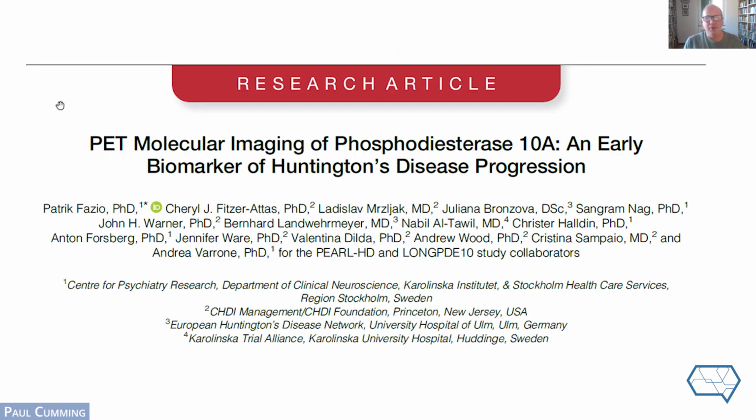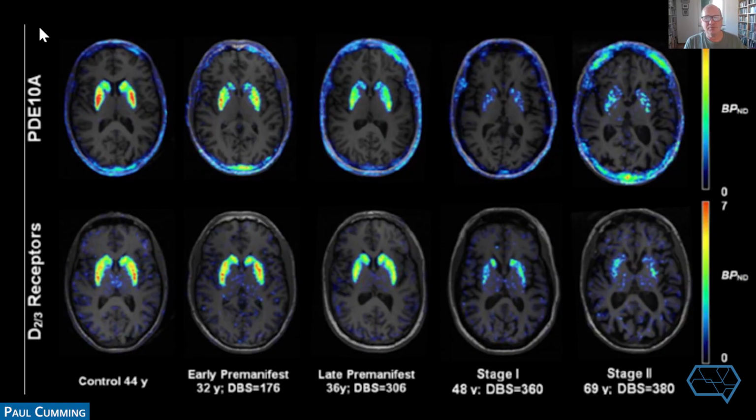Yes, here we are. These people did a very new kind of PET using a ligand for phosphodiesterase, which is a signal transduction molecule. And in the very final slide, please proceed. You can see in the upper figure that as Huntington's disease progresses, the abundance of this marker of second messenger signal transduction declines inexorably from the control case to progressively disappearing completely in advanced Huntington's disease. And this occurs in parallel with the decline in dopamine receptors. And I believe that is where I stop and where I had planned to stop.